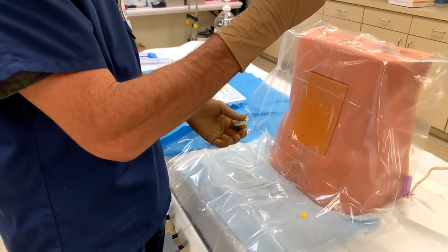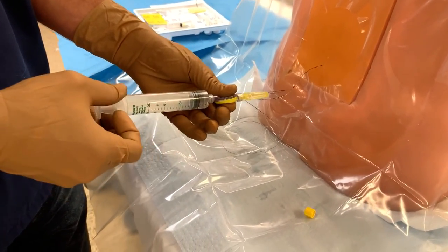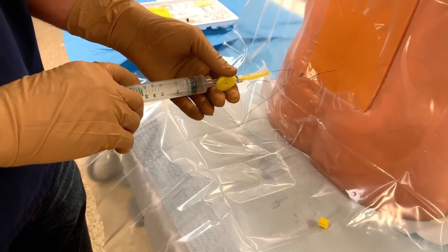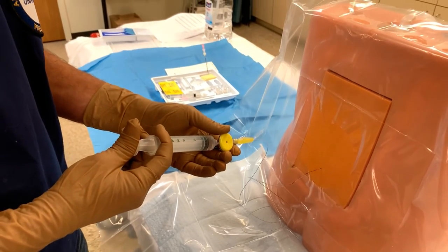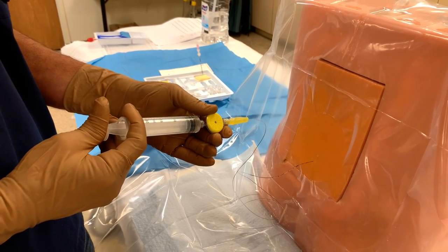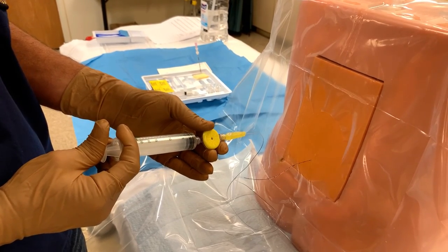The test dose is 1.5% lidocaine with epinephrine 1 to 200,000. Aspirate gently, making sure we don't see blood or CSF. We'll inject three cc's, telling the patient to let us know if they have any ringing in their ears, numbness in their mouth, or metallic taste. We're listening for pulse ox changes — a sudden change in heart rate would indicate an intravascular injection.